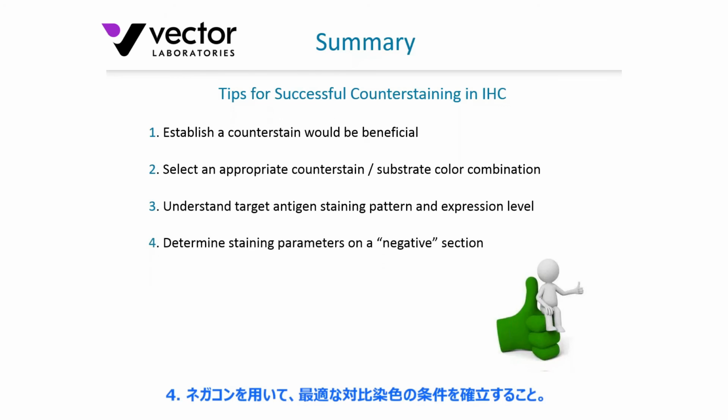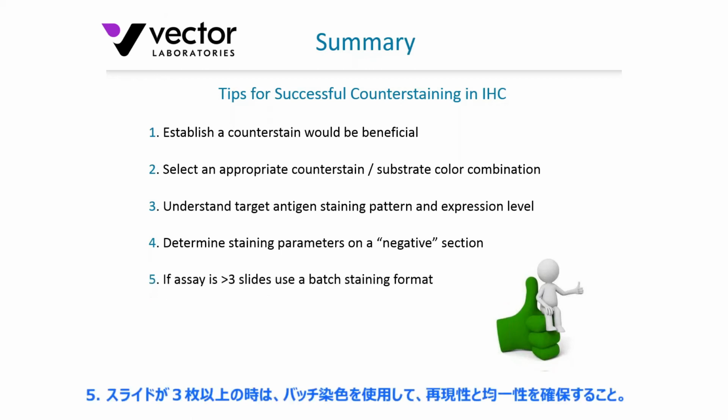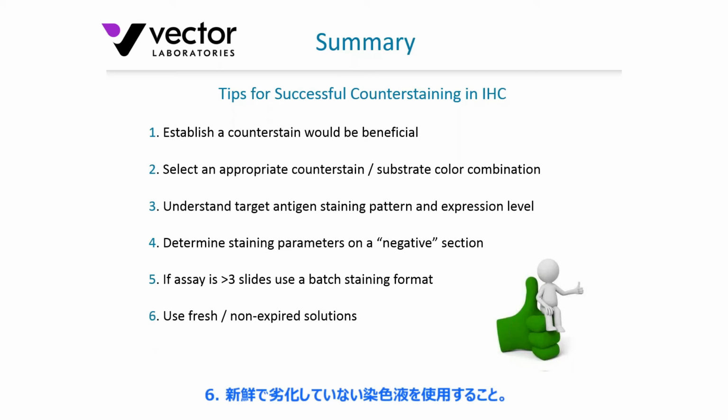This is where you'd want to run a defined negative control and work up those defined staining parameters. As we just mentioned, for any more than say about 3 slides, I'd highly recommend using a batch format for consistency and uniformity across all of the sections or slides that you're working with. And certainly use fresh or non-expired material, obviously, for the best results.